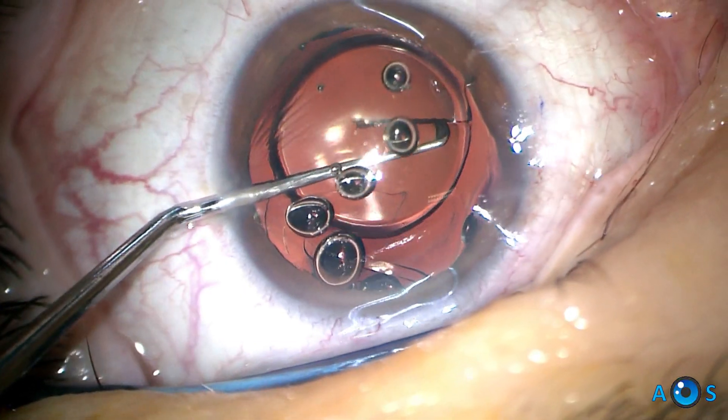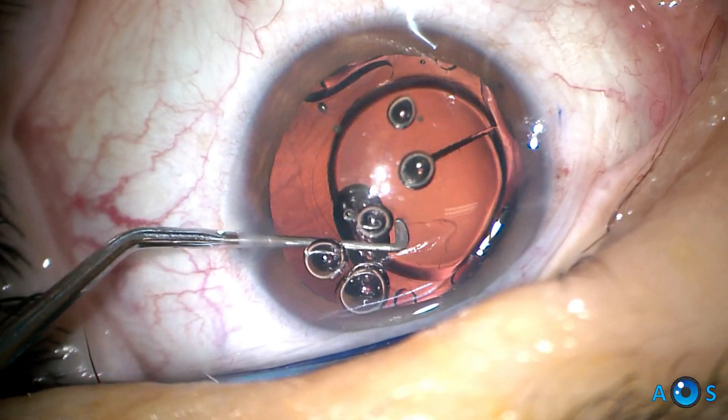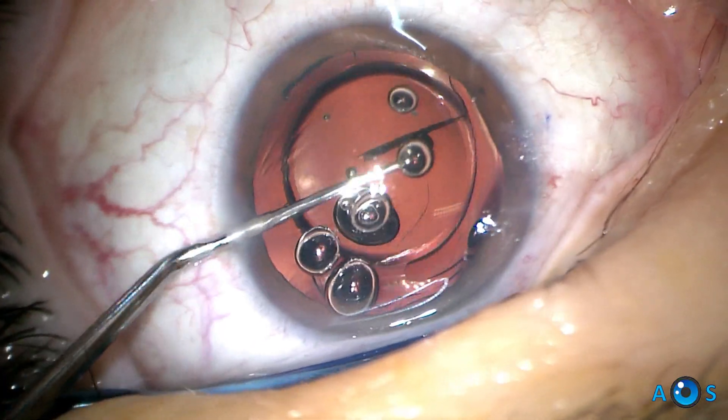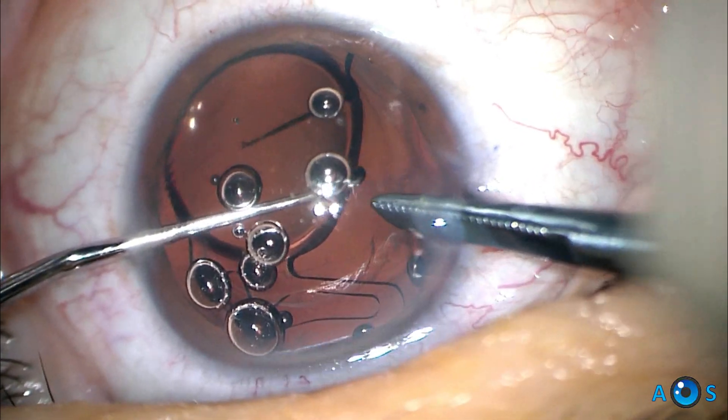The first cut is created, and gentle rotation of the IOL is performed, turning about 60 to 90 degrees in order to perform a second cut, aiming to create a slice of about a quarter of the optic area.